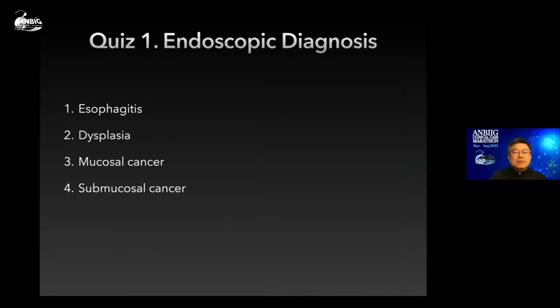This is case number 2. From these findings, what is the endoscopic diagnosis?